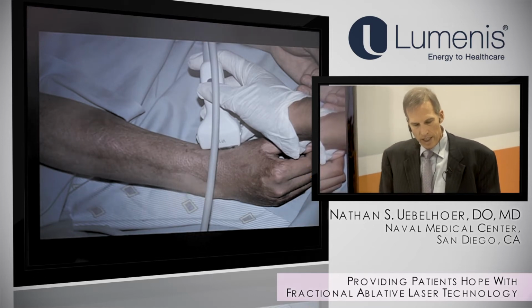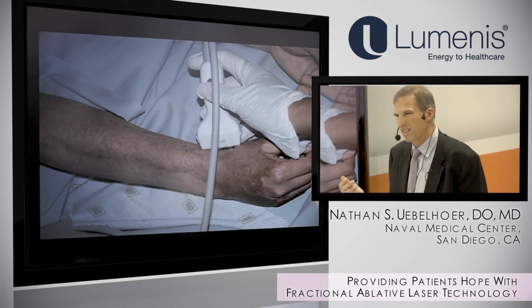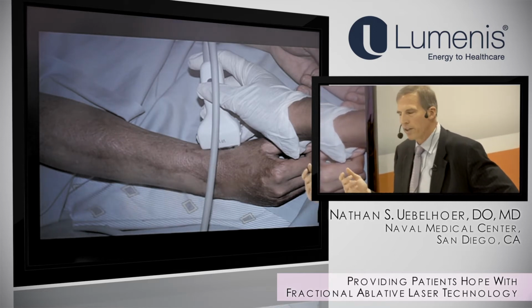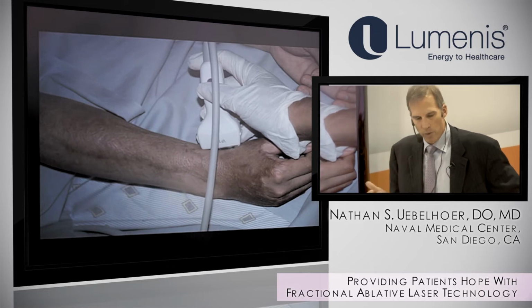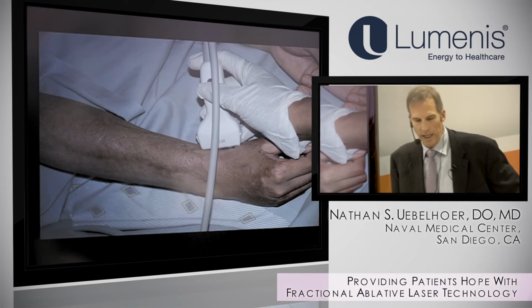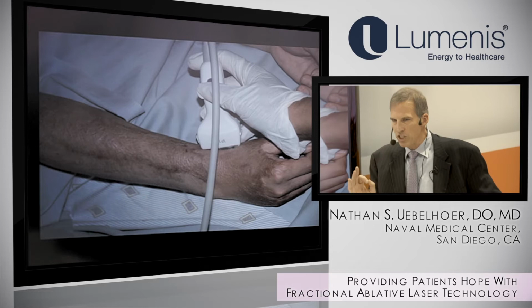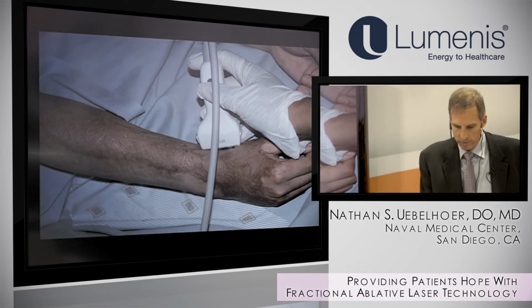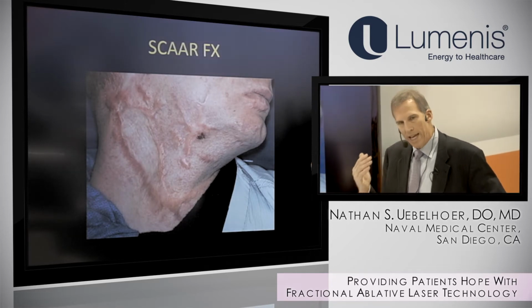Now, we were concerned we were going too deep on some scars because some scars seemed atrophic. Then when we would do high energy or high frequency ultrasounds to try and determine the depth of the skin, we realized that a lot of these scars were over 3 millimeters that we thought were less. But what we started doing even more was matching the scar depth with the energy, and I think that's very important. So Lumenis came up with, we asked for more energy.